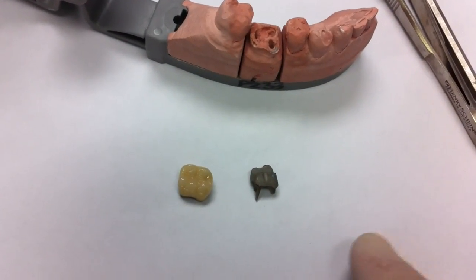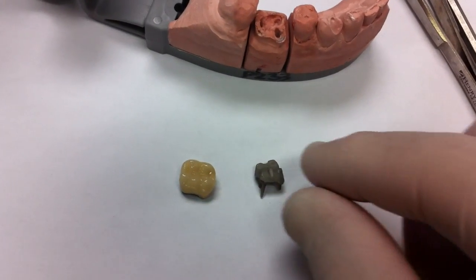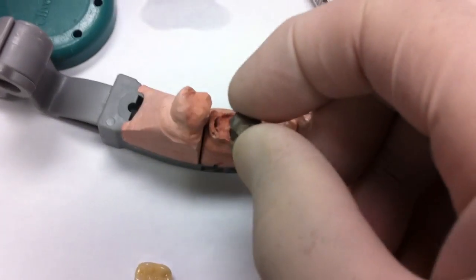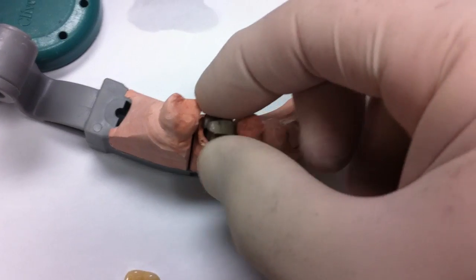Here we have a case — a post core and a ceramic crown. Here's what the post core looks like with three posts. This is a model of the case.